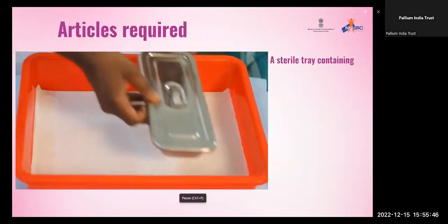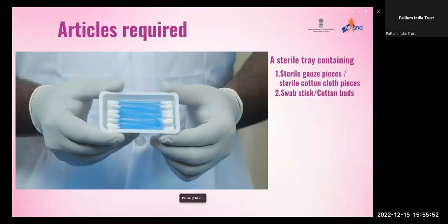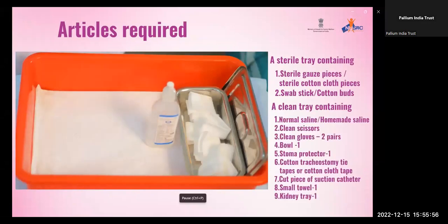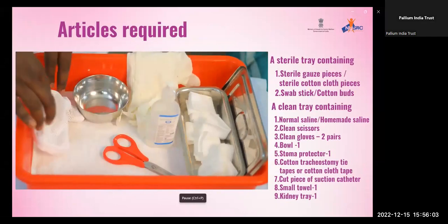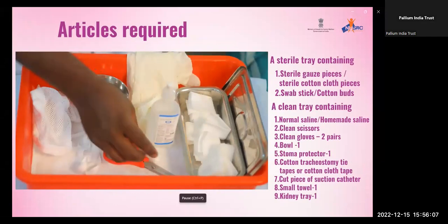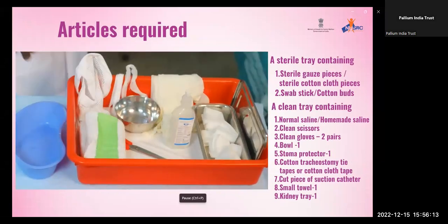Articles required: a sterile tray containing sterile gauze pieces or sterile cotton cloth pieces, swab stick or cotton buds, a clean tray containing normal saline or homemade saline, clean scissors, 2 pairs of clean gloves, 1 bowl, 1 stoma protector, cotton tracheostomy tie tapes or cotton cloth tape, a cut piece of suction catheter or brush, 1 small towel and 1 kidney tray.